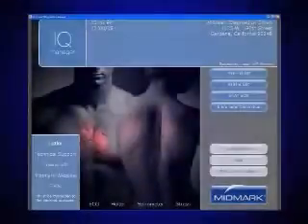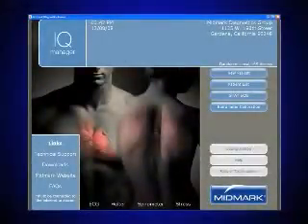In this video, the IQholter is being operated with the IQ Manager software. For EHR/EMR customers, please contact Midmark Support Services at 1-800-624-8950 option 2 for any additional instruction you may need.